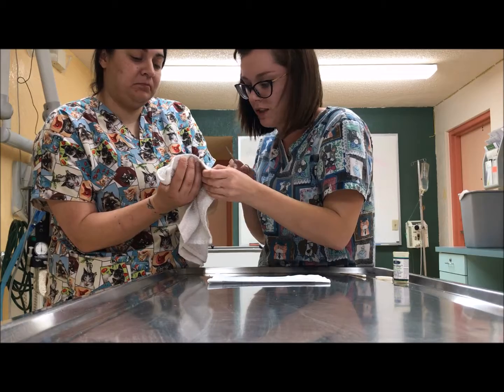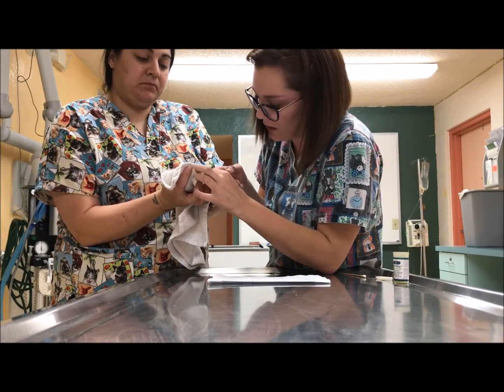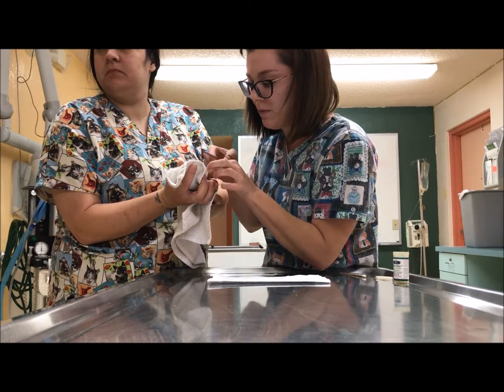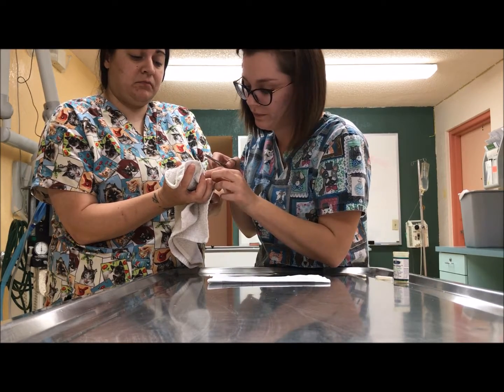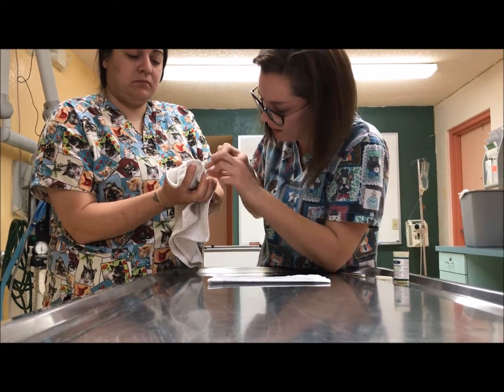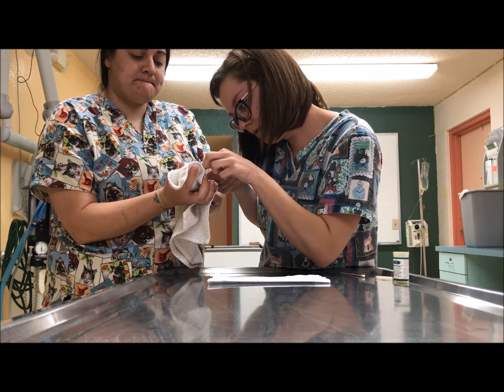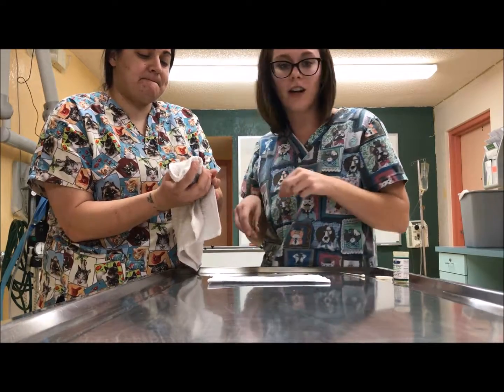All right, and then you move on to the next little foot. And one thing I want to mention while I'm doing this, it's really important when you're restraining birds to make sure that you are not pressing down on their chest at all, because that can restrict their breathing, and that's not a good thing. All right, and there you go.